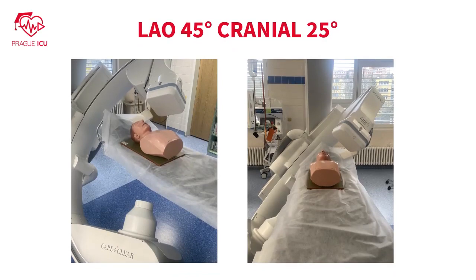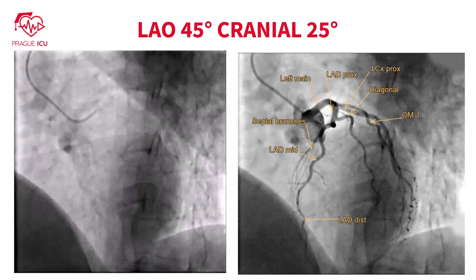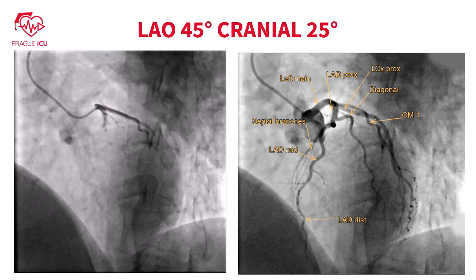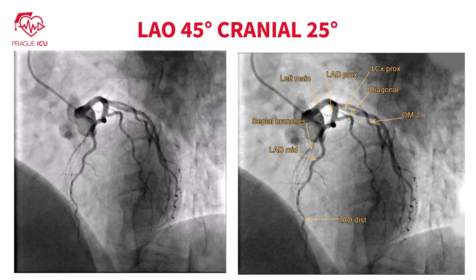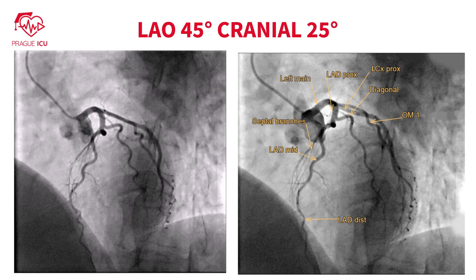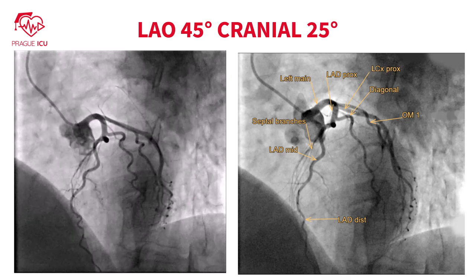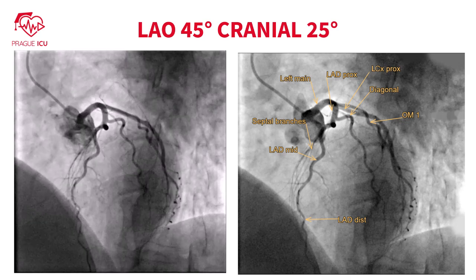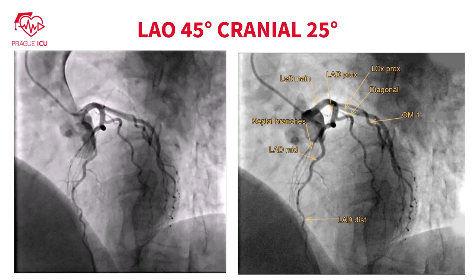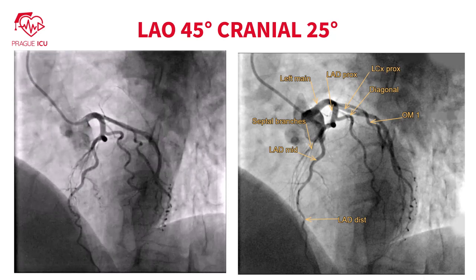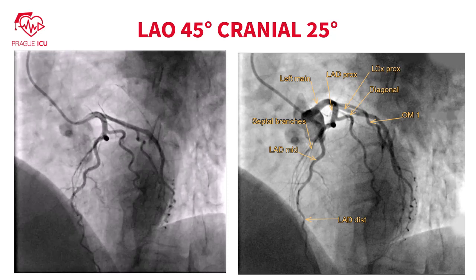Left anterior oblique 45 degrees cranial 25 degrees view is best for visualizing the ostium of the left main and then the mid and distal LAD with origins of diagonal branches, which are on the same side as the obtuse marginal branches. Septal perforators are seen to the opposite side.